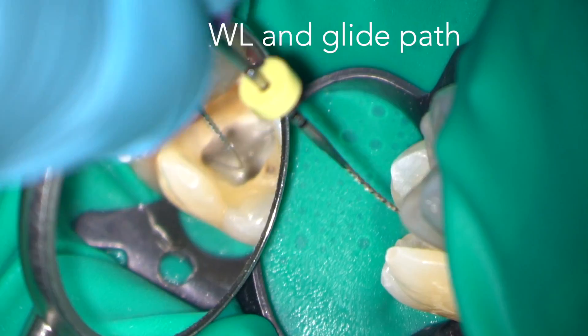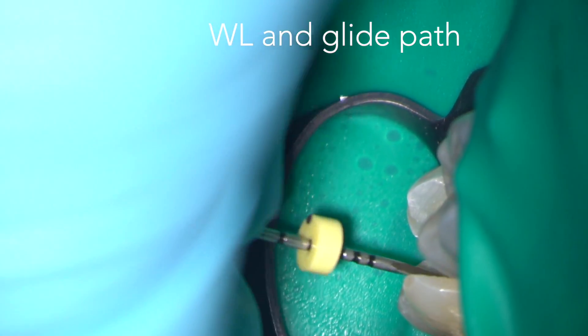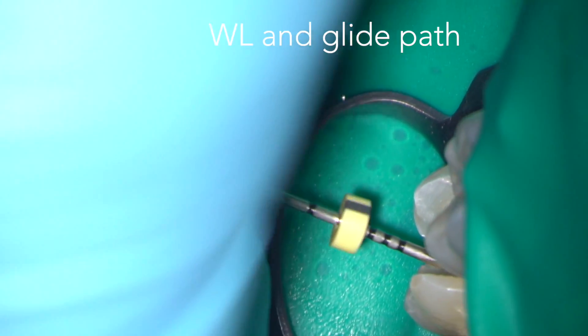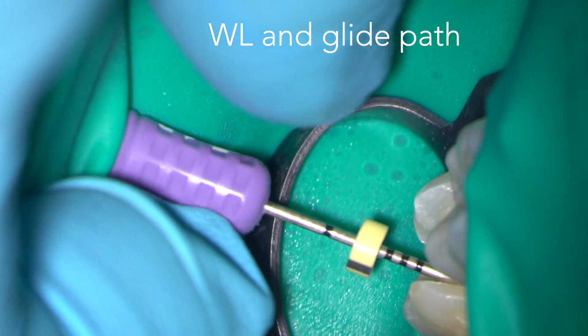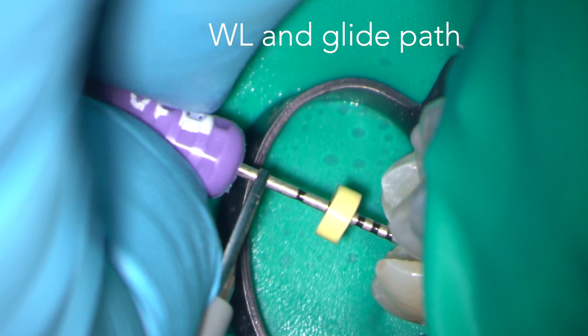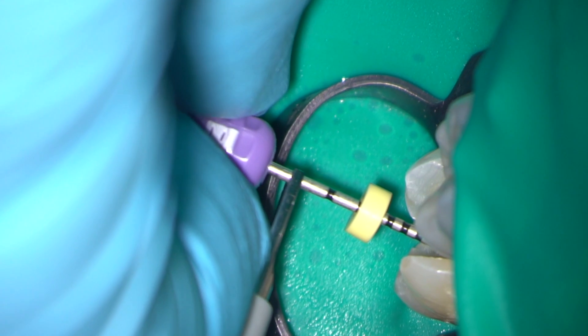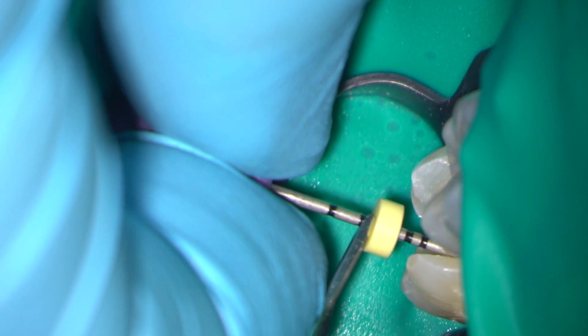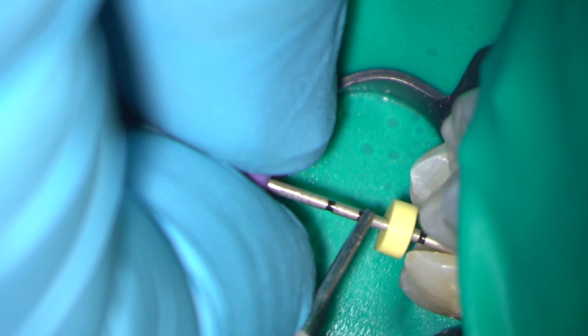It's now time to estimate the working length of the root canals and establish a glide path. I'm doing this with a size 10 flexo file, using a watch-winding action and an electronic apex locator to confirm the working length. I'm then using a light, small-amplitude filing action to really create a reproducible glide path.